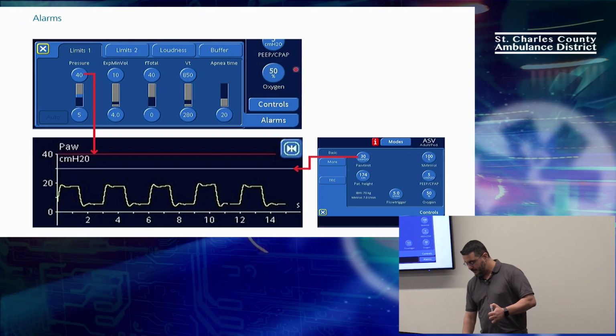This is what I wrote up for the pediatrics. I was going to confirm that. Yeah, but it uses a different calculation basically. For adults, it uses 10% for your minute volume. For kids, it uses up to 30%. It starts off at like 3 kilos or something like that, and then up until 30. It starts off at 30% at the 3 kilos, and then it goes down to like 20% somewhere halfway there, and then up until 30 kilos. Once you hit 30, it's 10%. Does that make any sense? Or okay, we just probably confused everyone. I'm sorry, guys.